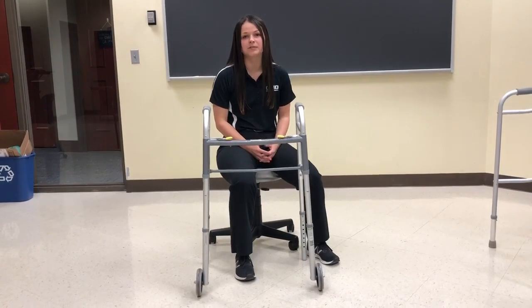Moving on to the rolling walker. Its main characteristic is that the 2 front legs of this walker have fixed wheels at the bottom. These wheels allow for a more normal gait pattern, but it does compromise one's stability. Also, because of its 2 fixed wheels, it requires a larger turning arc when the patient wishes to change direction.